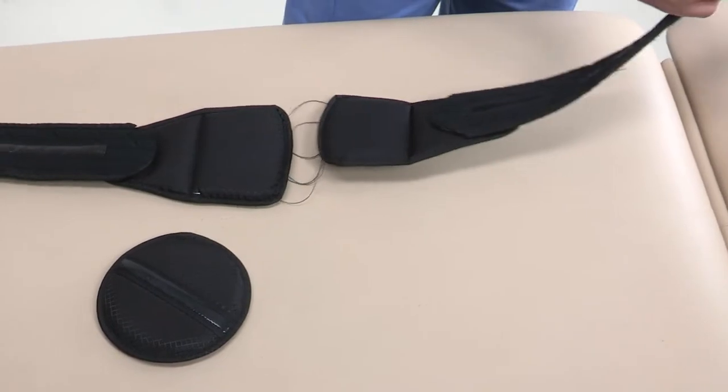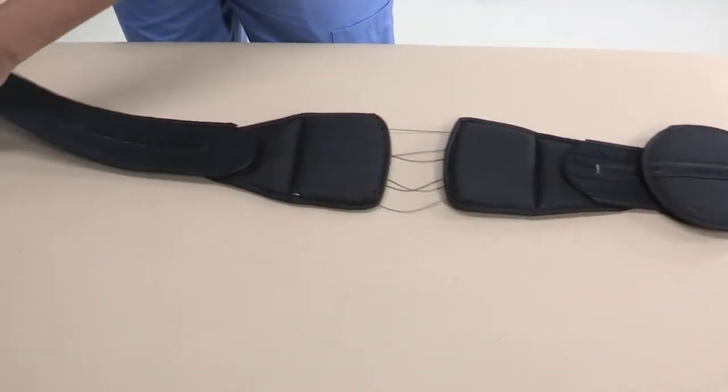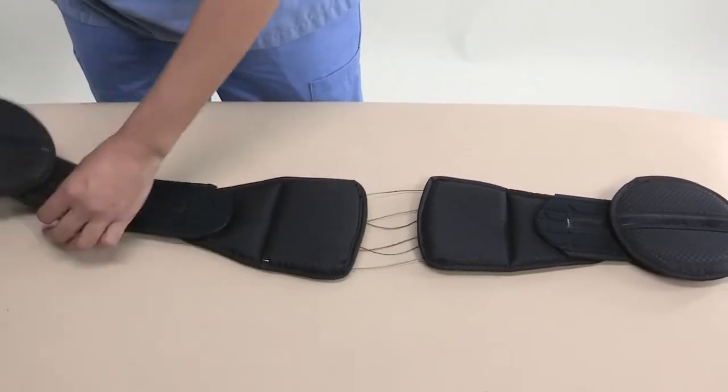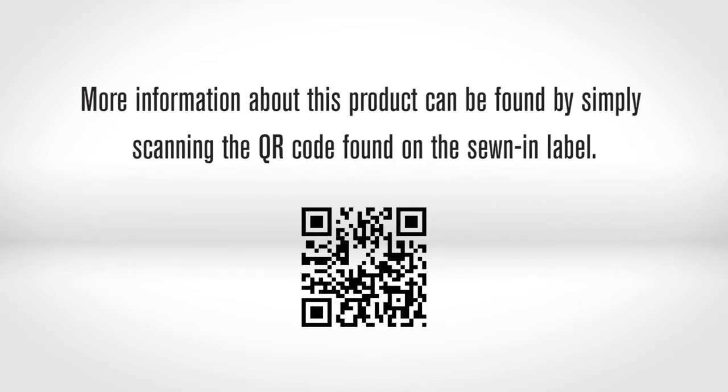Belt pads: Slide the belt wing through the elastic strap on the belt pad so the anti-slip material is facing the patient. Repeat on the opposite belt wing. More information about this product can be found by simply scanning the QR code found on the sewn-in label.